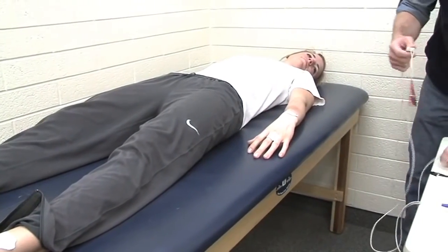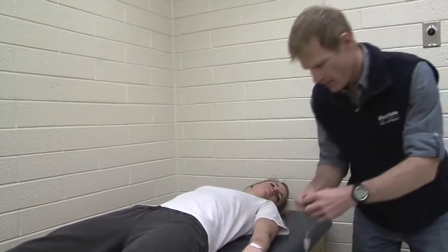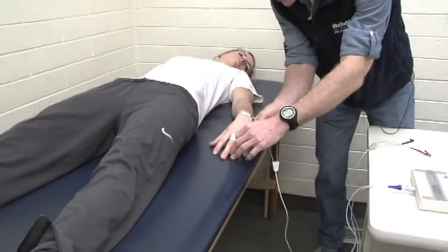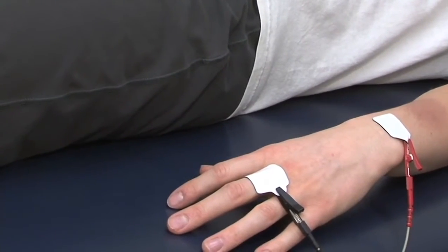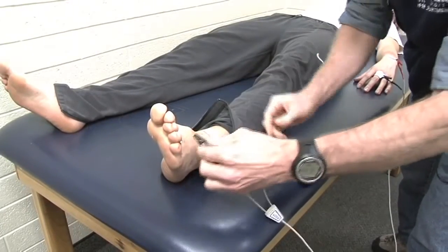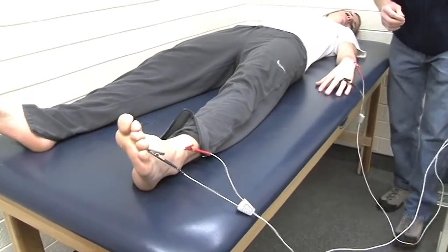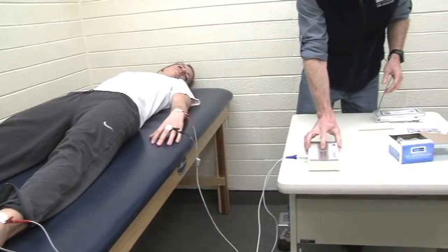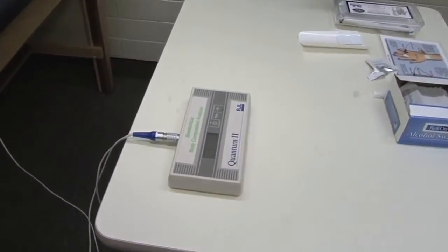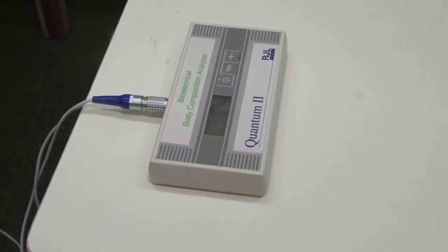We're just going to hook up the electrodes. We have red and black leads, just like hooking up a battery on a car, basically. The red lead is proximal, the black lead is distal. It's very simple — I just turn on the device and it's going to give me a resistance reading. This is measuring the resistance to the electrical current going through her body, and this number is in ohms. Right now she has 534 ohms.